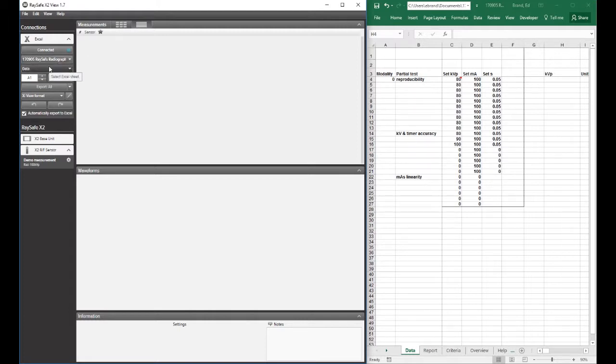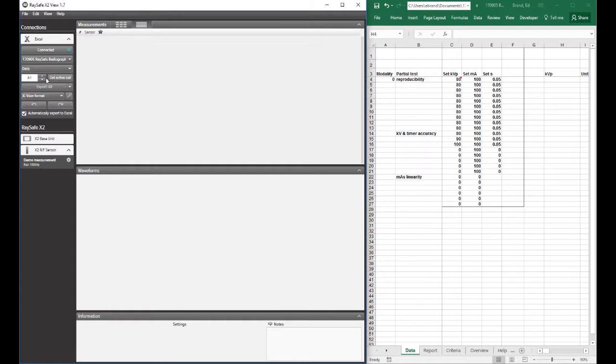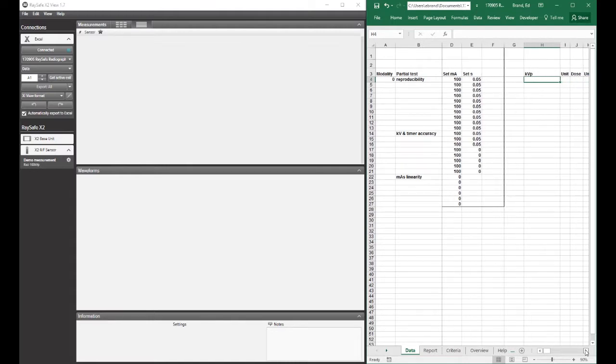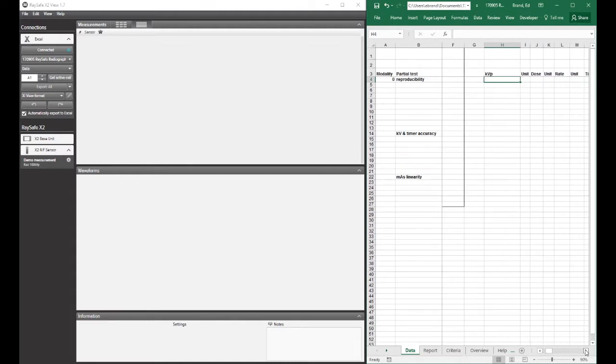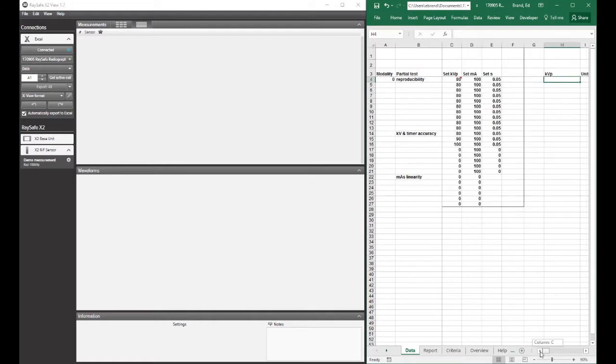I'm going to export my data to the data worksheet, and I'm going to start data collection in cell H4. So row 4 will be populated with information from the first exposure. So kV, dose, dose rate, exposure time, et cetera, will all populate in row 4 to begin with.